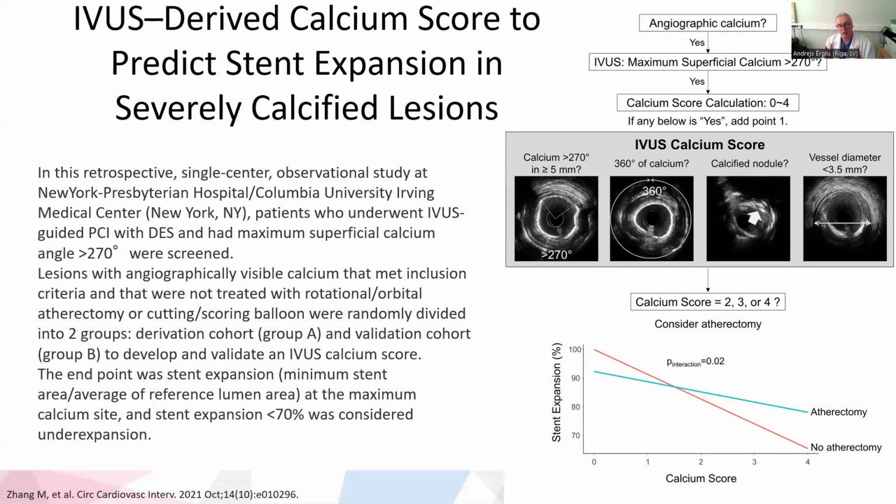And also it is important because we can then predict the intervention success, or maybe even predict what will happen with the stent if you put it in this unlikely environment. That's why we need to prepare a vessel for stent implantation, for scaffold implantation. For this reason, there are very good devices like both IVUS and OCT.